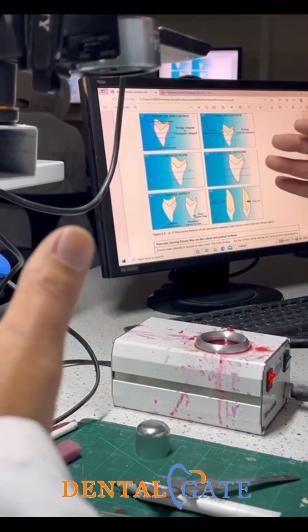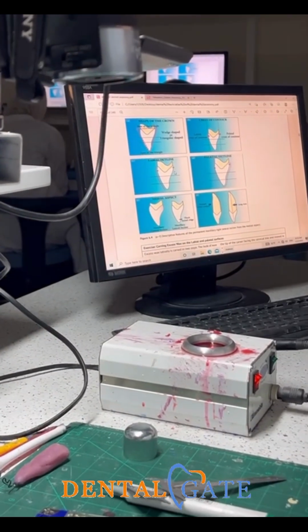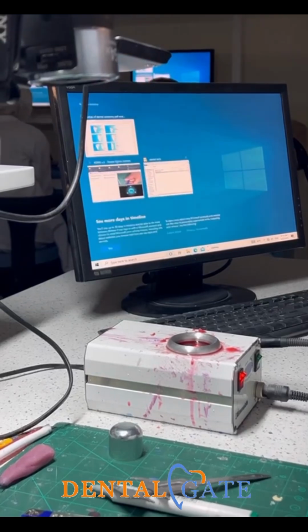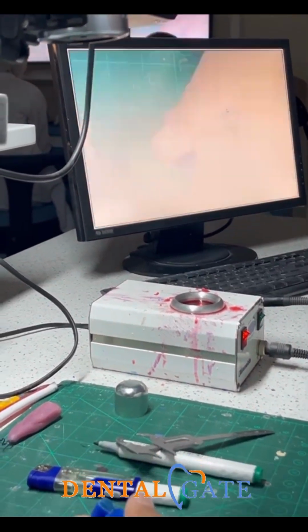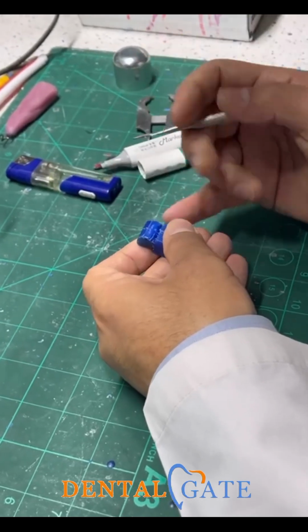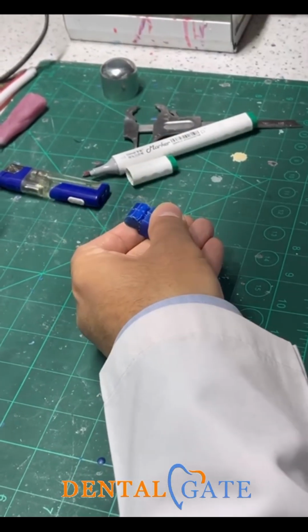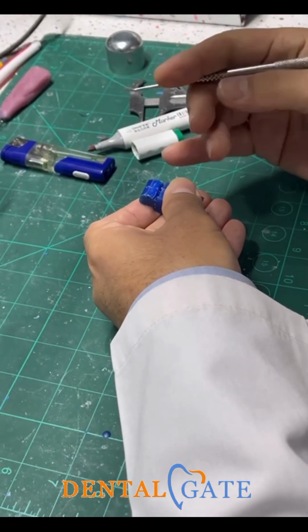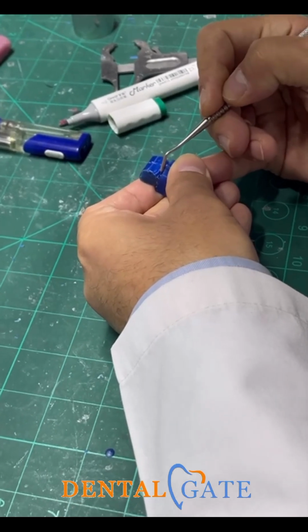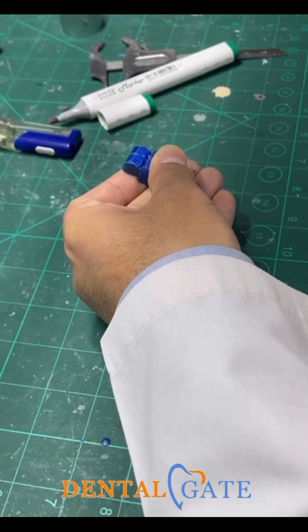If my base will be correct, and I have 1 length, just add the shape of the crown at the distal aspect. So I will need now 6 millimeters. It will just be put upon what? At the cervical third. This is the 5 millimeter. Just put it here. Just put it 1 millimeter more than the cervical. So there is no difference here.